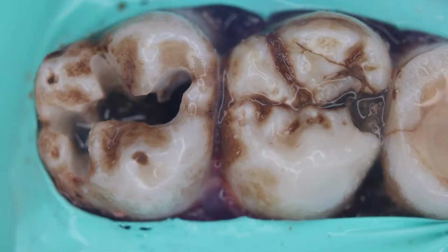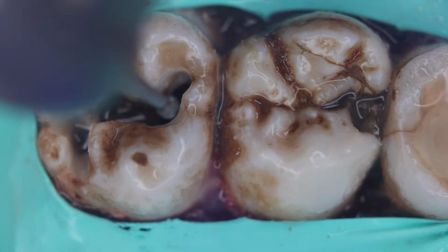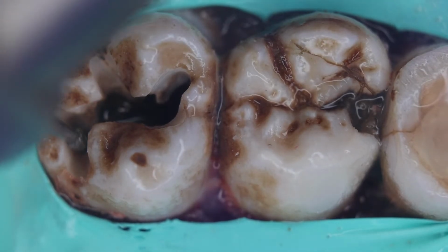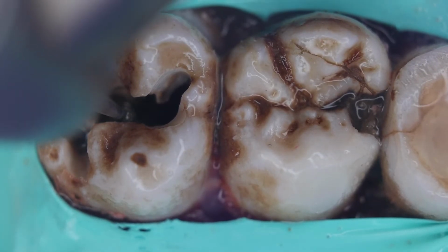So now you can see the depth that we are covering initially with this burr. That is, we are going up to the ball or the depth of this burr and not going beyond it.